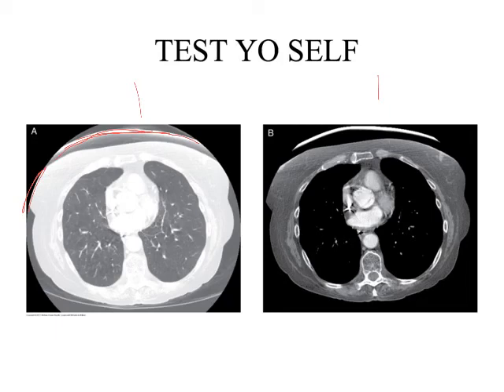It's a big no-no for us as radiation therapists, right? Definitely don't want to clip the breast that you are trying to simulate, right? You may have to clip the breast of the opposing side, right? So this is a constant give and take for us when we're using all this technology for simulation, and this is just kind of a segue towards some of our activities as well as what we're doing next week.